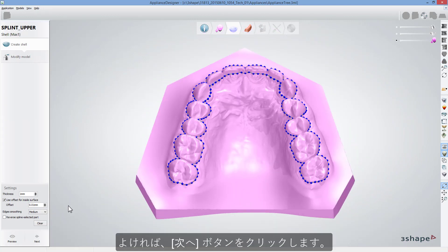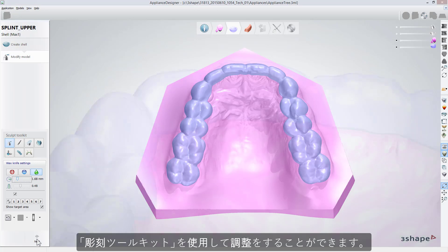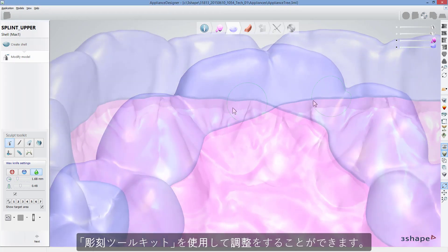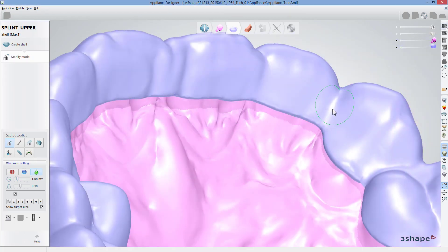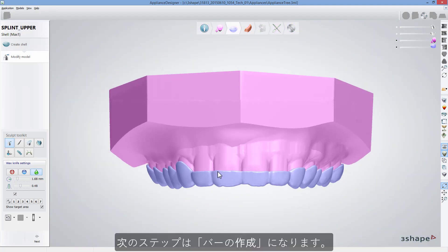If you are happy with the design, click Next. Now you can adjust the design using standard Sculpt Toolkit. If there is a need for that, the following step should be the bar creation.